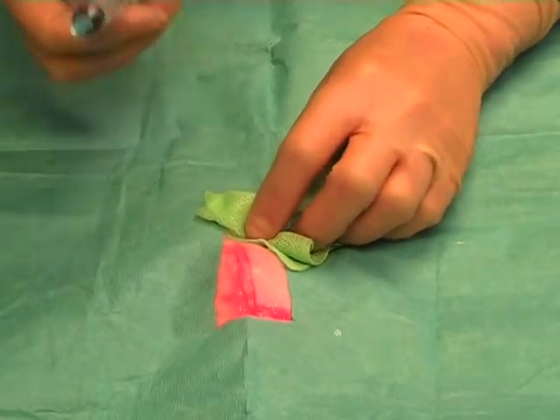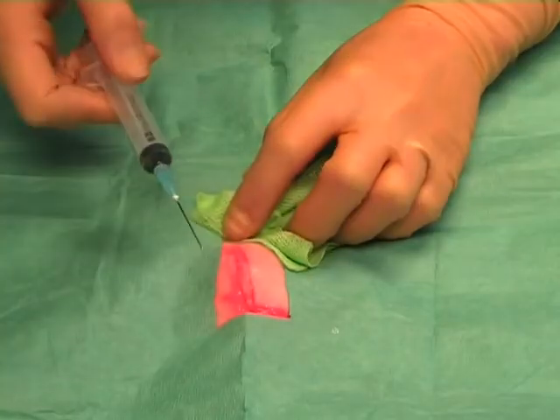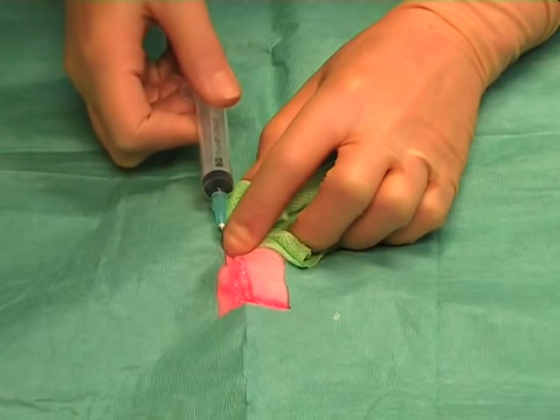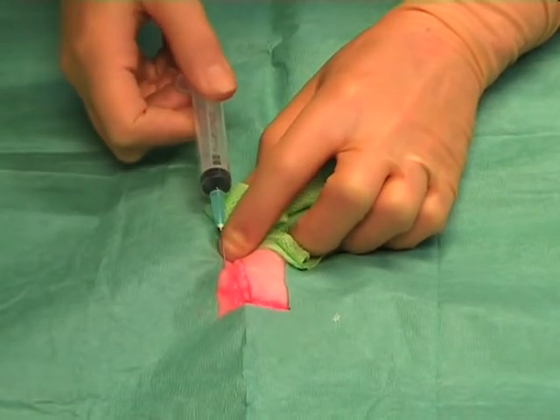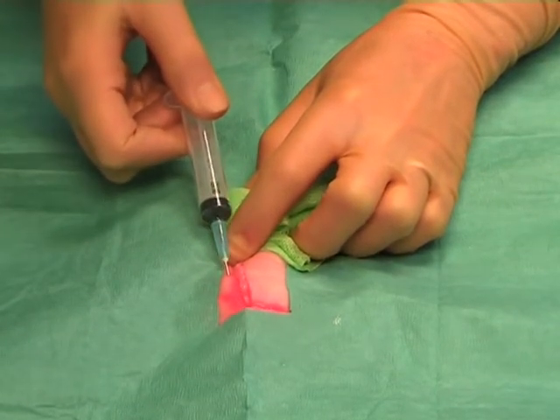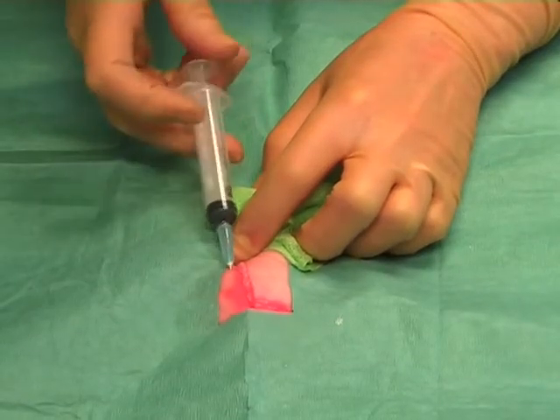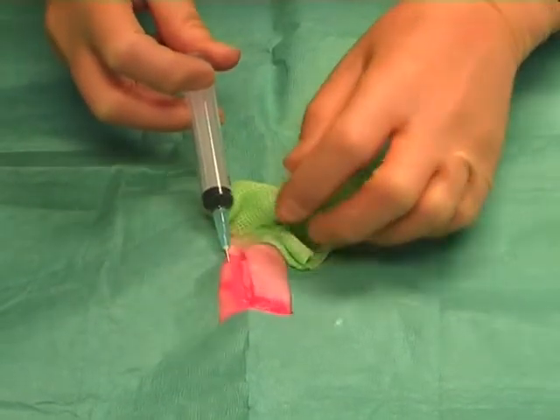If the wound is longer than the length of the needle, you can reinsert the needle at a point along the wound edge and repeat the process, passing the needle along the wound. Draw back and again inject as you withdraw.